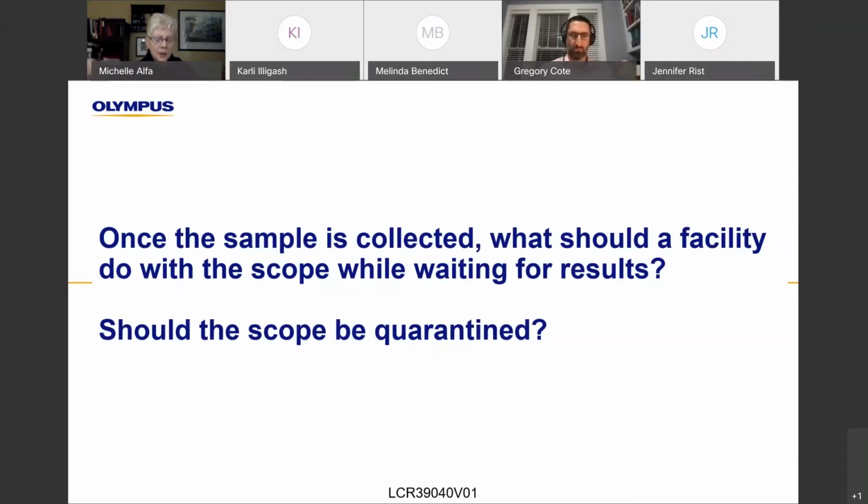It would be good for a number of weeks to actually do some scopes every week for a period of time until you've got a sense of what the status is for the duodenoscopes within your site. And then after that, determine what the frequency will be. Again, the FDA protocol doesn't specify it, but trying to do some scopes every week allows you to assess a wide range of the scopes that you've got and have some knowledge or indication about the contamination rates in them.